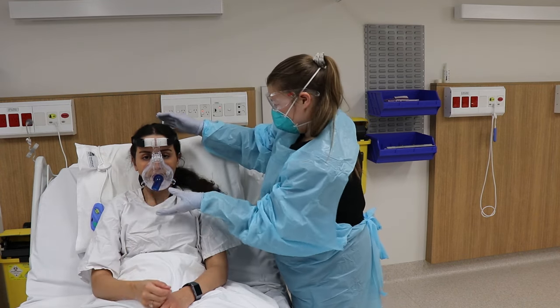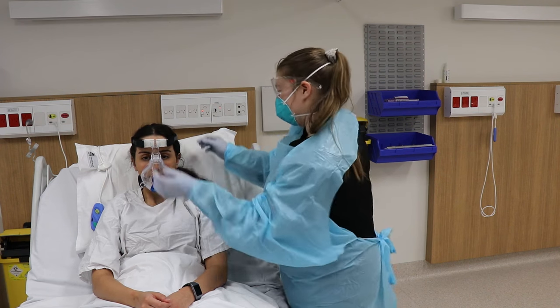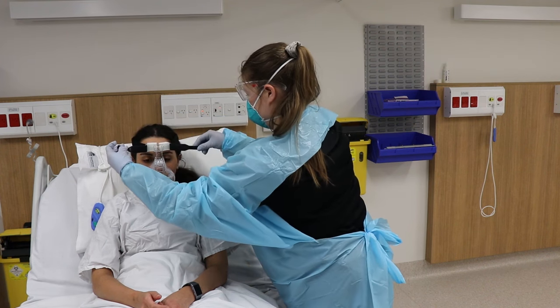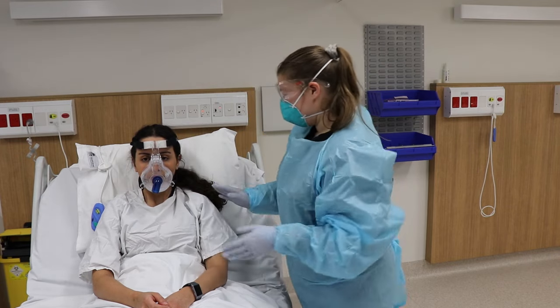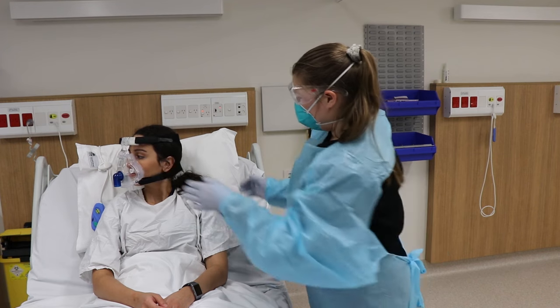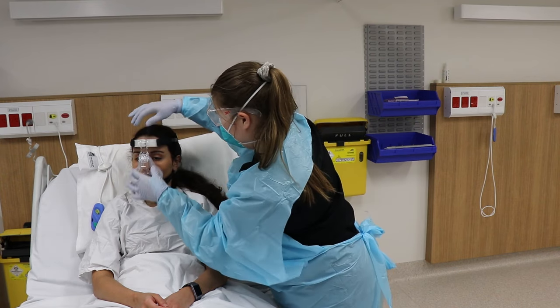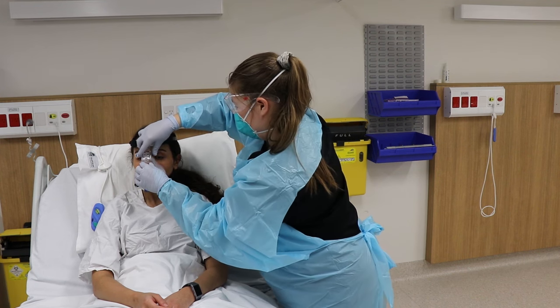The mask should be firm so that it doesn't fall off, but it shouldn't be so tight that the seal looks like it's bent. Gently placed on the patient. Could you turn your head from one side to the other for me? Just going to check again — this nose piece is looking a little bit bent. This part can be adjusted a little bit more forward or a little bit more back.